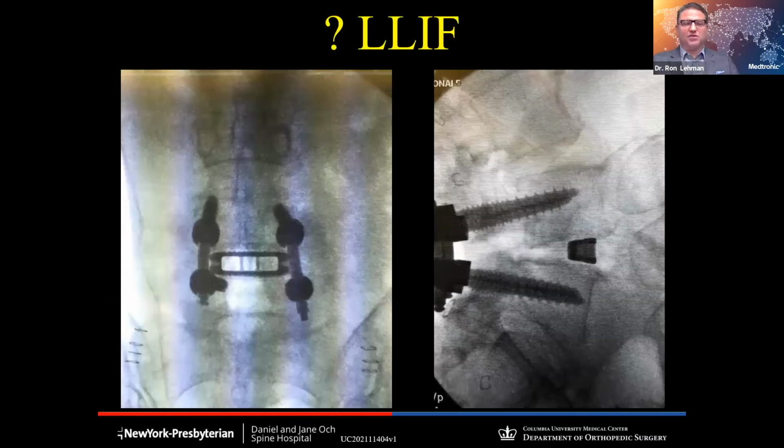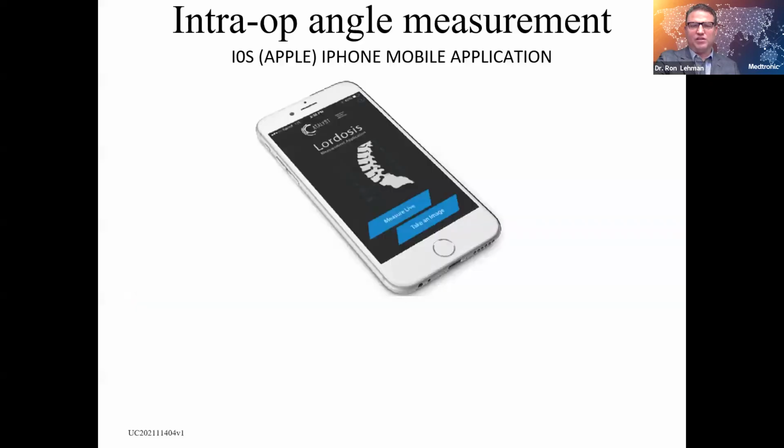And then we get asked sometimes, well, is this a lateral based surgery? Because you can see this cage is a 35 millimeter cage. It's quite large, and it looks like you place this, that Neil did one of these fancy operations where he places it from the side. But once again, these operations are with the TLIF. And now that we have better implants, like the one on the right-hand side, we can do a really good job of achieving lordosis.